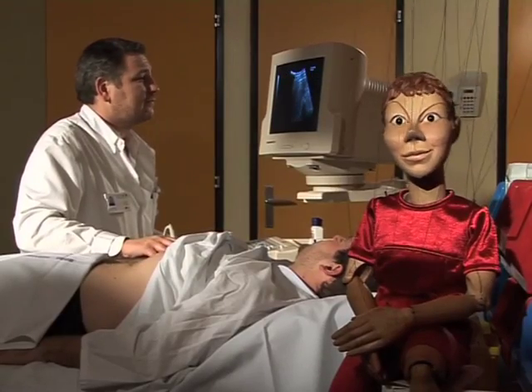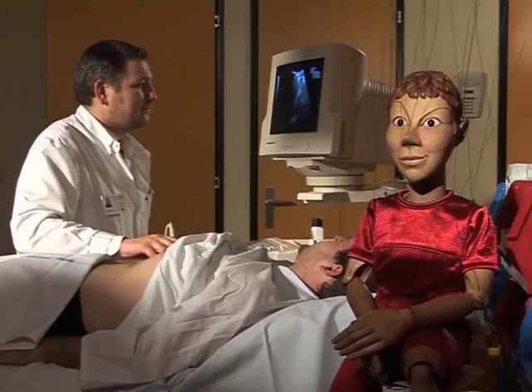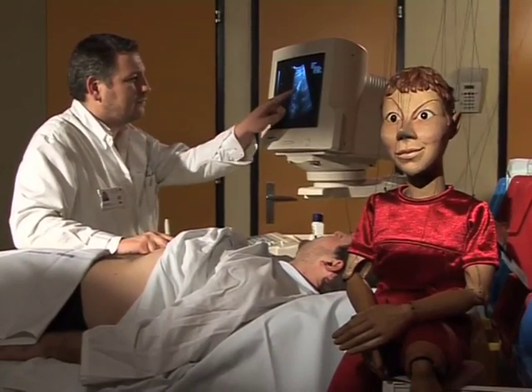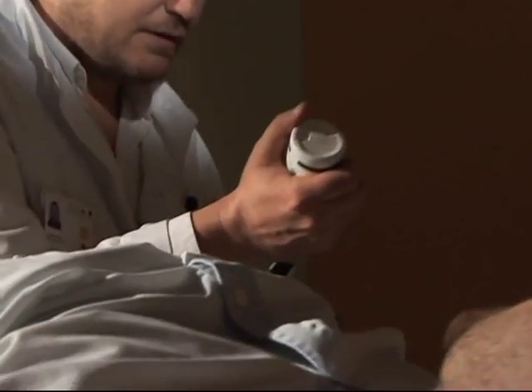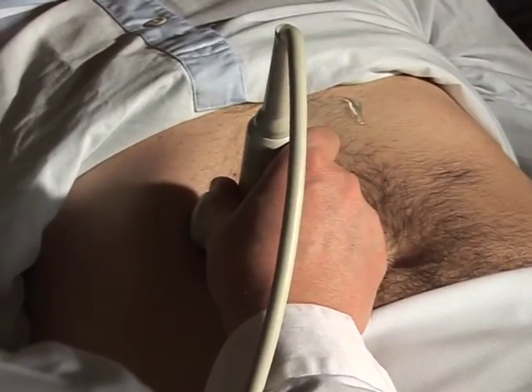There are no specific preparations needed, except for certain types of abdominal scans. In such cases, we ask you to fast or, in others, not to urinate beforehand to make sure that your bladder is full, which helps us to observe that particular area of your body more clearly. Now I'm going to apply more gel.